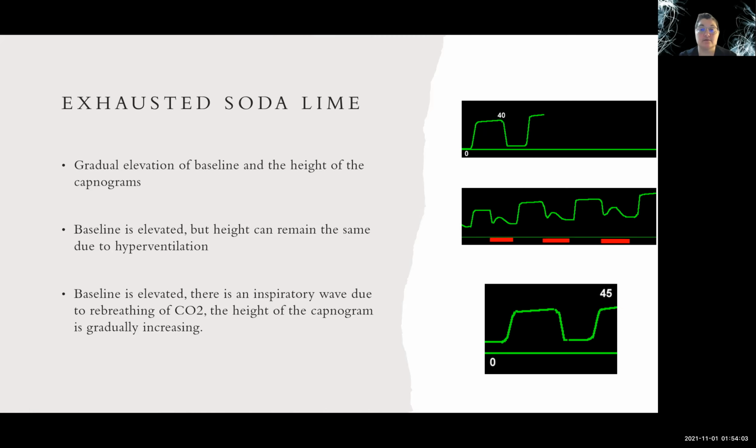Another way to tell that you're dealing with exhausted soda lime versus hyperventilation is to look at where your baseline is. Where is phase 1? Is phase 1 touching zero, or is it elevated? If it's elevated, like in these 3 images, then you know you need to change your soda lime.